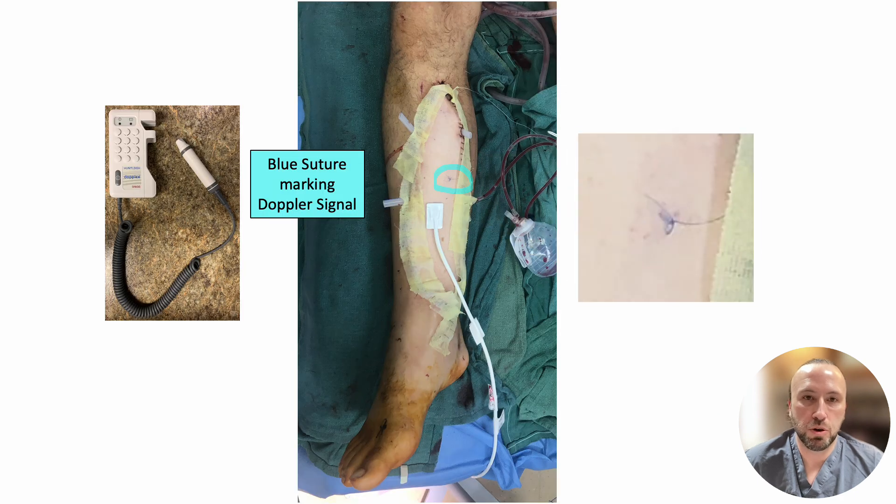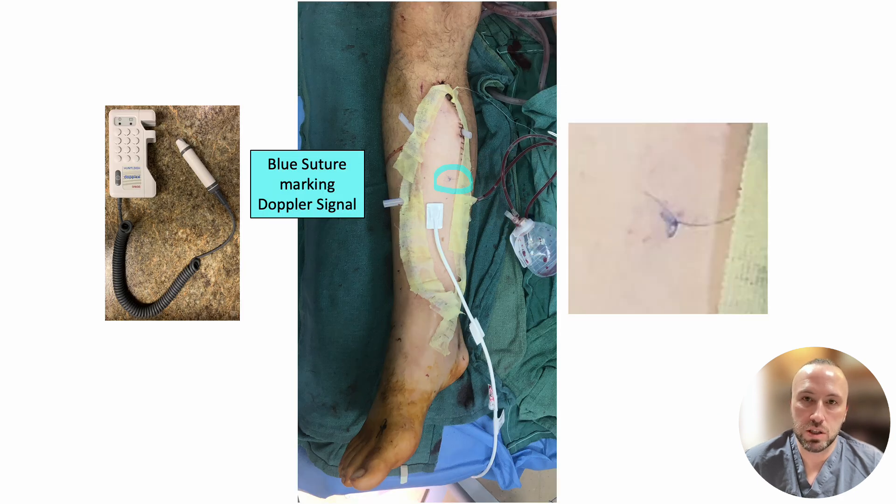The location of this perforator where the best Doppler signal or pulse can be found is marked during surgery with a blue suture so it can easily be located for monitoring after surgery. This blue suture marks the area where you should use the handheld acoustic Doppler to perform your Doppler checks.